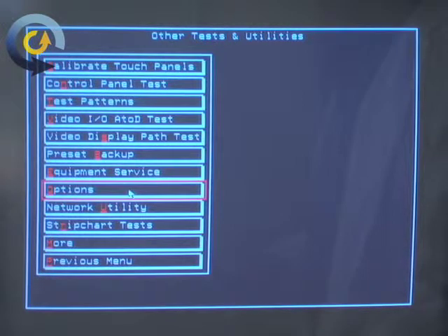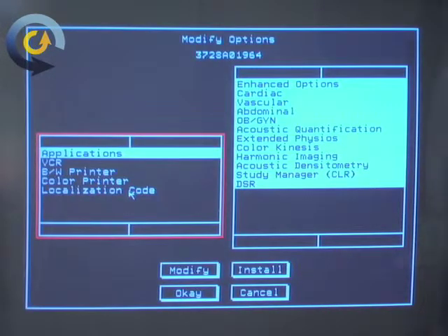Here on the option screen, again, this now is the actual listing of the active and licensed options for this machine. Had there been any dark areas, that would indicate that the system has the capability of performing that function. However, it has not been either licensed, authorized, or activated. And you would talk with your service or sales provider to determine which of those conditions exist. In this case, we're looking at applications.